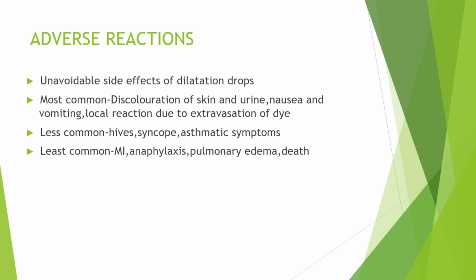For reducing the nausea and vomiting, we can inject the dye slower, over 5 to 10 seconds, which reduces the chance of nausea and vomiting. We can also give antiemetics prophylactically. And to prevent anaphylaxis, a hydrocortisone injection is also given along with the dye.